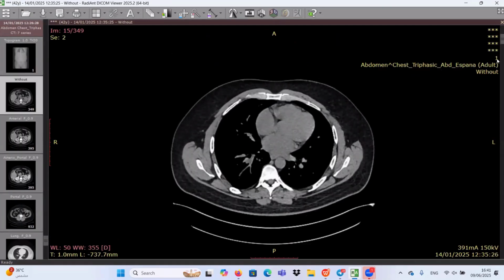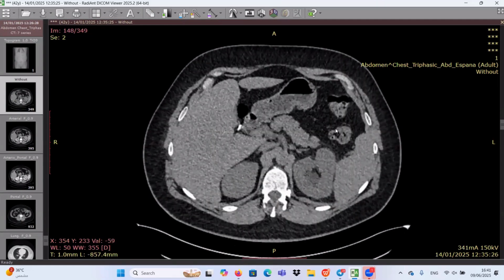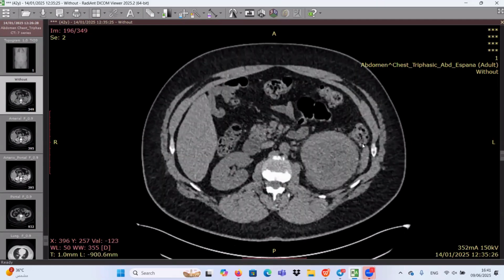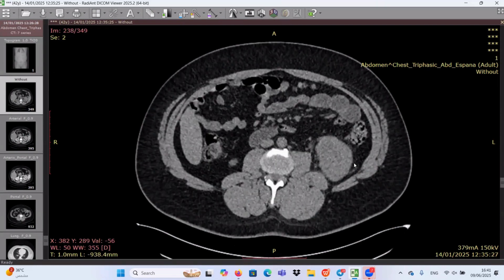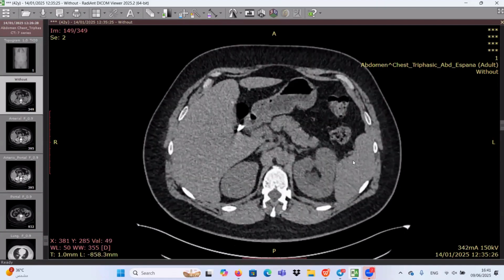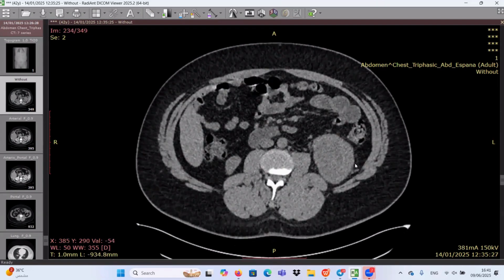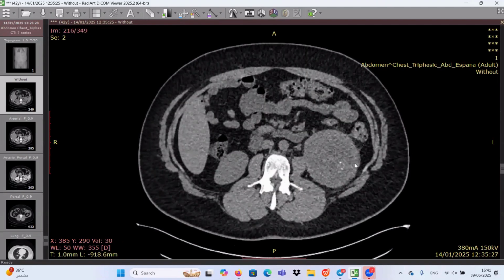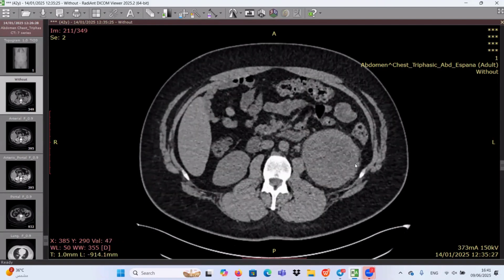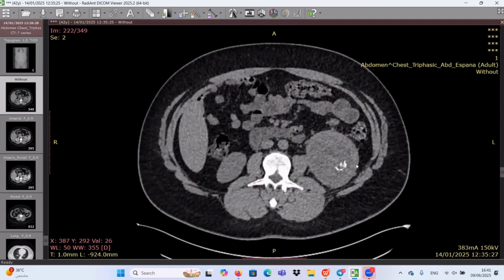This case is a young adult male patient complaining of hematuria. I have been provided with the CT scan of the abdomen and the non-contrast CT scan of the abdomen. I can see that the left kidney is relatively enlarged. There is a hypodense mass lesion involving mostly the upper pole of the left kidney, and I can also see some calcification areas within the mass.